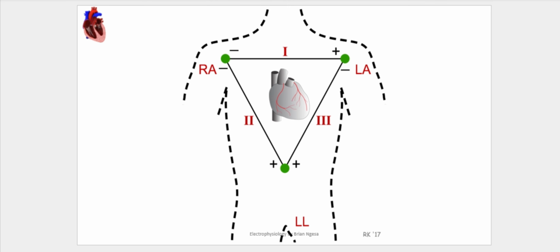So when we'll be coming up with an ECG, while focusing on a particular lead, for example, in our case, the lead 2, as the action potential is spreading from the sinoatrial node to the atrium, towards this direction, you'll be able to say that it is moving away from the negative onto the positive, and we'll be able to see what to jot in our graph.